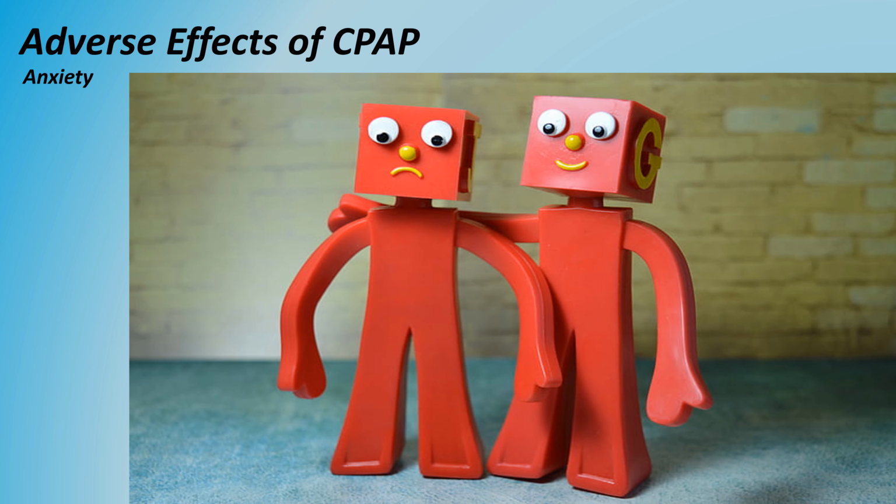We already talked a little bit about anxiety in relation to respiratory distress and the application of CPAP. It also needs to be mentioned that claustrophobic anxiety can occur at any point during treatment and needs to be managed quickly to keep the patient tolerating therapy. This is especially relevant if your patient was on the decompensating end of respiratory distress and has had an improvement of status with CPAP treatment.